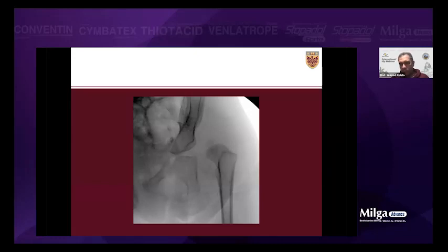For the pelvic osteotomy, Gigli saw versus osteotome: if you do a Salter osteotomy, the Gigli saw will be a better option. But if you do a Dega or Pemberton osteotomy, then you need straight and curved osteotomes. Once I reach this point, then I'll go back to the first interval.